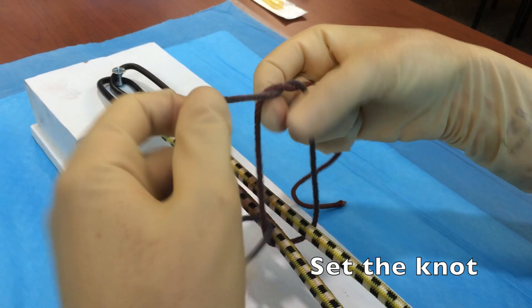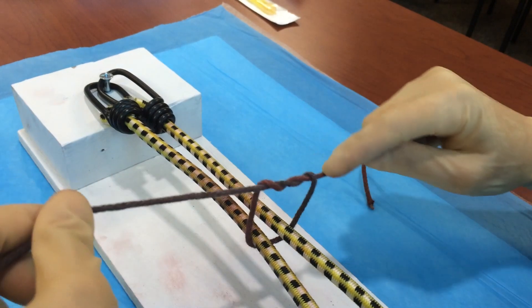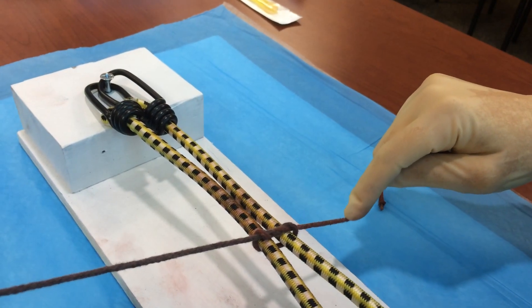To set the knot, we're going to create that bird's beak and pull that free strand in our left hand through the loop twice. Then pull it tight.